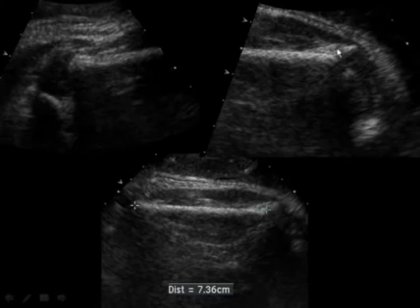And then at the far end of the femur, here's that distal femoral point and the epiphysis with a little bit of ossification in the center, and this is where the cursor belongs, at this end of the femur. And this gives us a more accurate femur measurement when these landmarks are used of 74 millimeters.